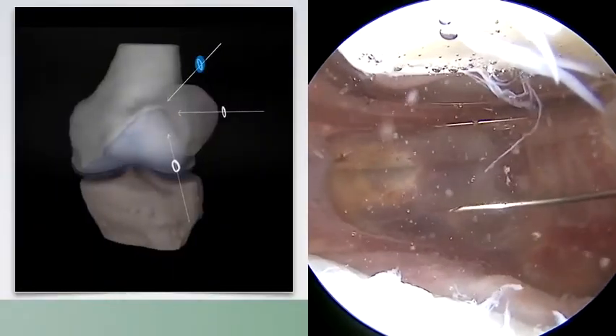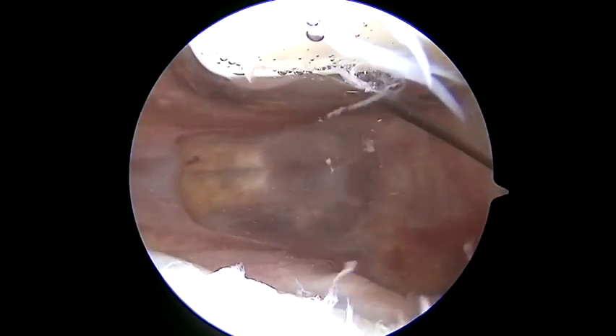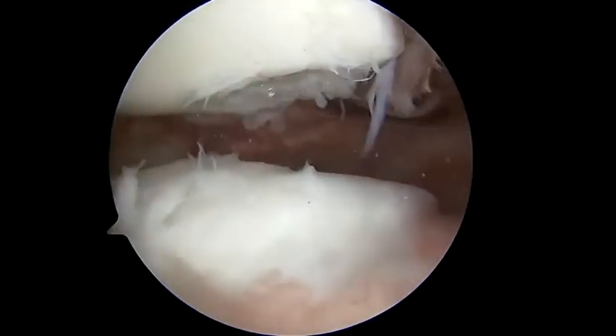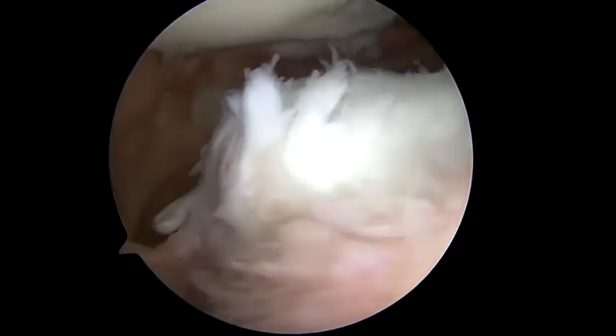We now spinal needle localize the superior lateral patellar portal, which can help with diagnostic arthroscopy as well as visualization of this spur. Here we can see the superior lateral trochlear damage as well as the patellar tracking and the distal medial patellar chondral wear.